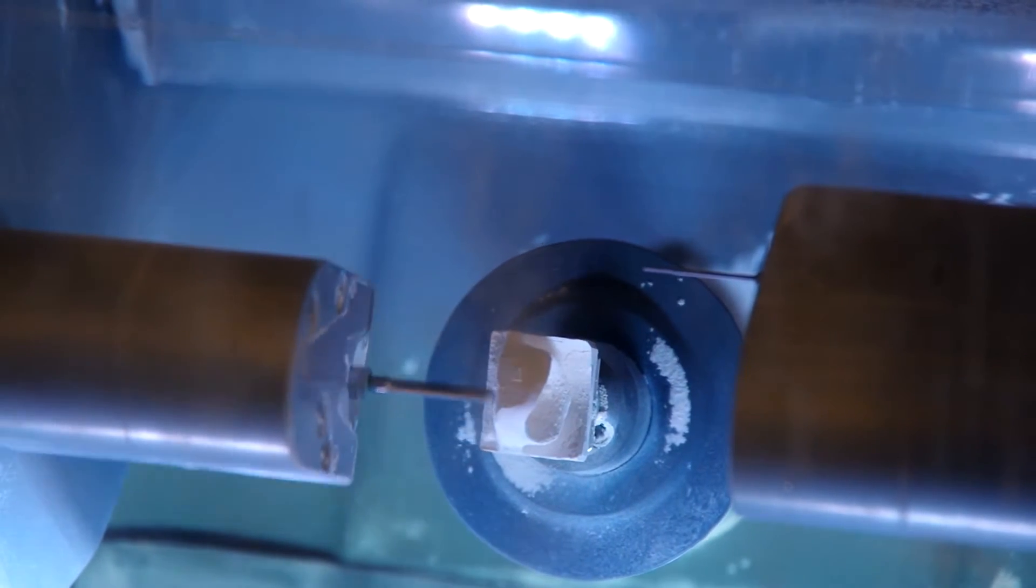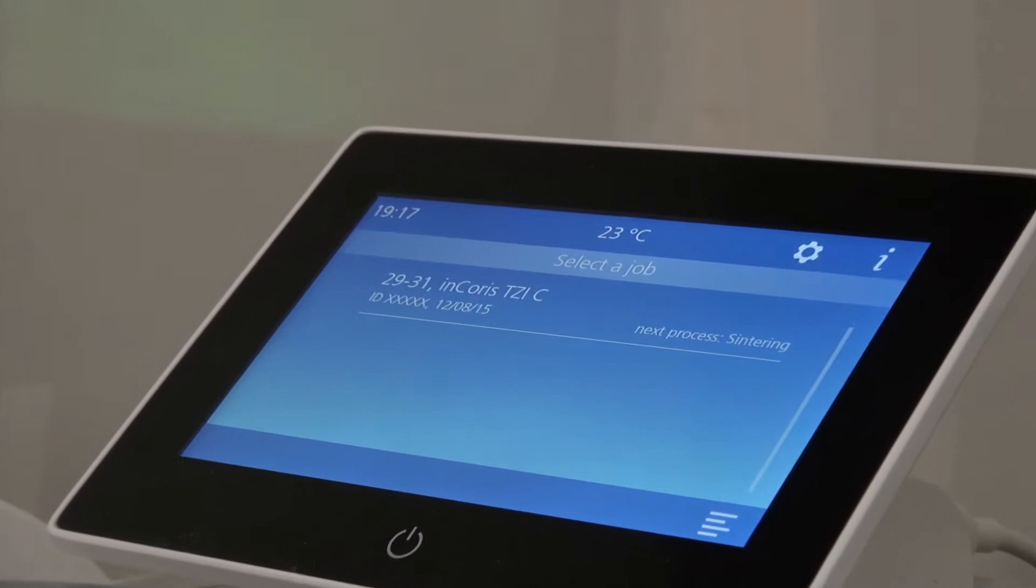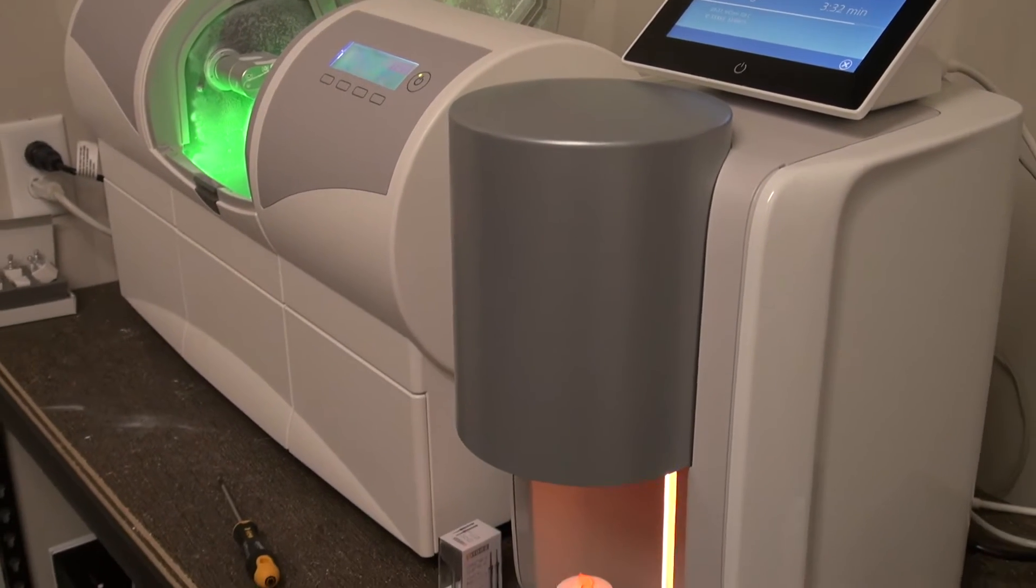We don't have to wait for the water to evaporate in the oven. That makes sintering easier. But guess what? Sirona came out with a new induction oven that actually sinters in minutes. So it's broken the barriers for zirconia. Now it can become chairside.